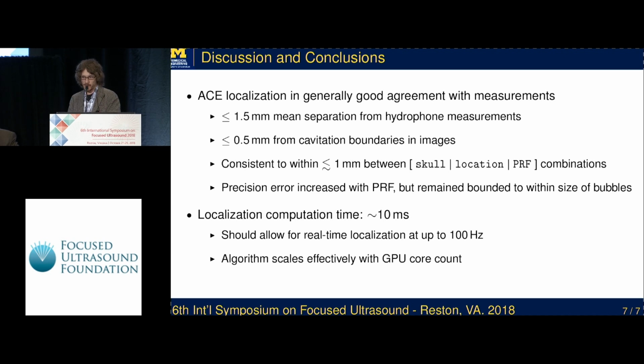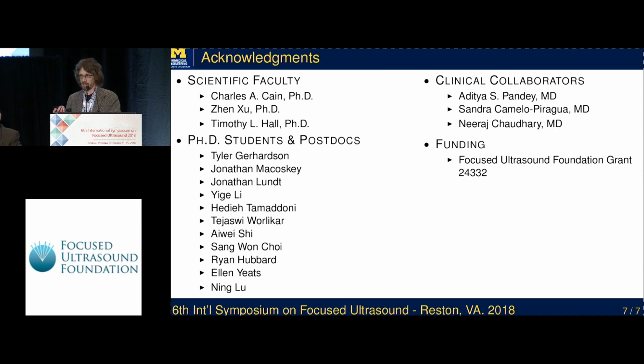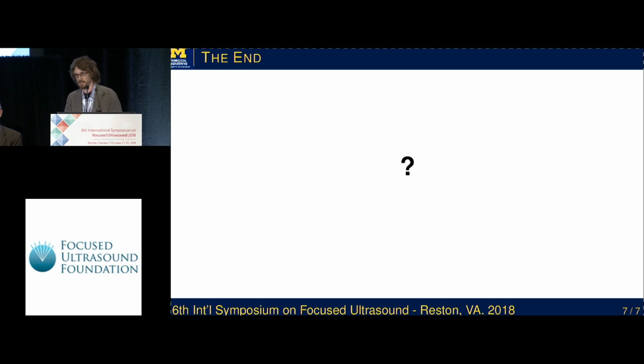And then computation time for this, it takes about 10 milliseconds to do this localization, so we can do real time up to 100 hertz, and the algorithm scales effectively with GPUs, so we should be able to get faster with better GPUs. And so with that, I'd like to acknowledge everybody and take questions.